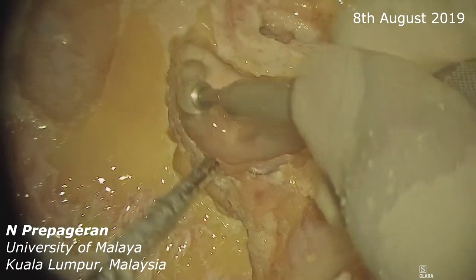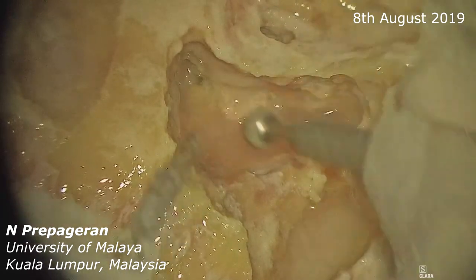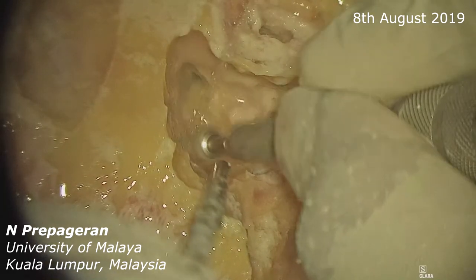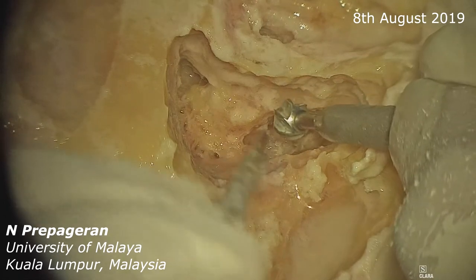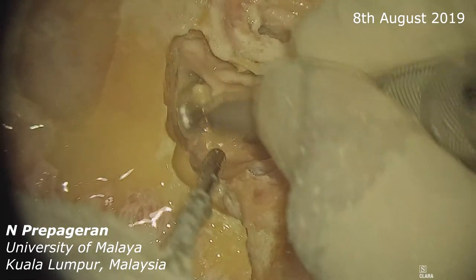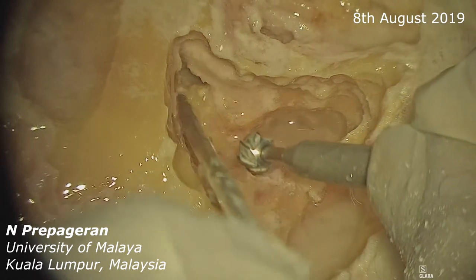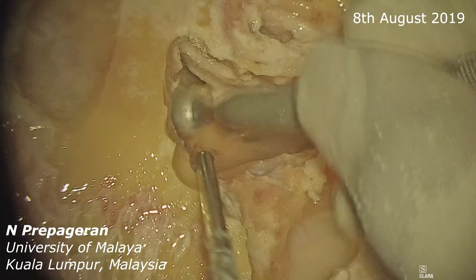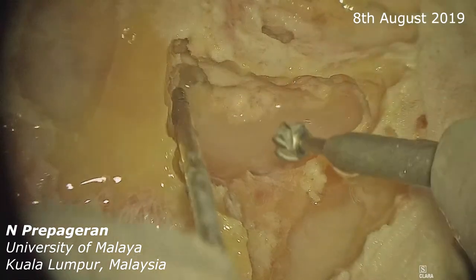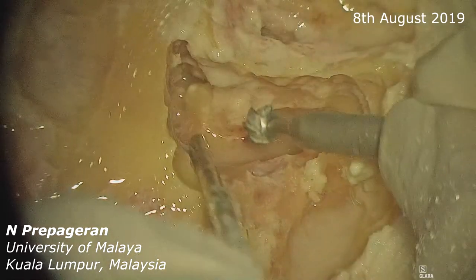So now the sinodural angle — the middle cranial fossa is being exposed. You can see now the lateral semicircular canal, and that's the posterior coming into view here. The same way now, let's go and find the superior semicircular canal. The superior semicircular canal is always deep. I can already see the ampulla of the superior semicircular canal just there — it's always quite high and quite deep as well. We can already make out the superior semicircular canal coming into view.